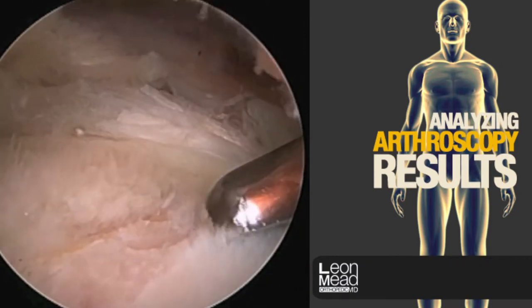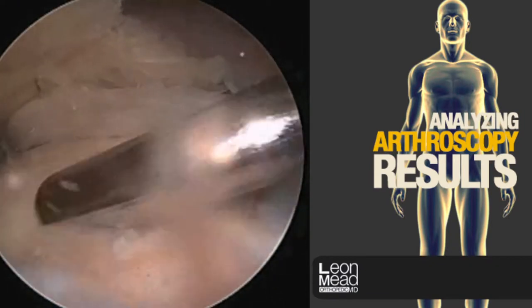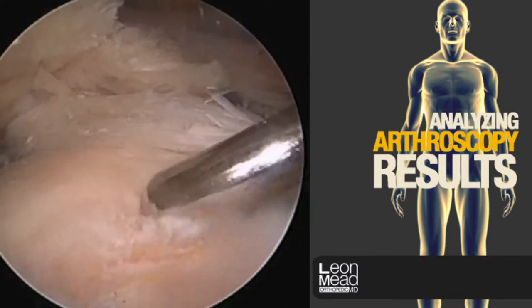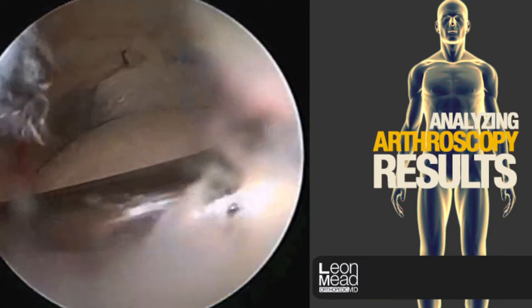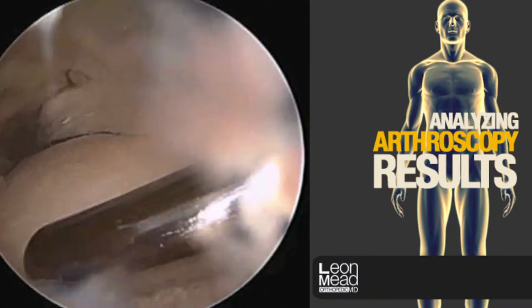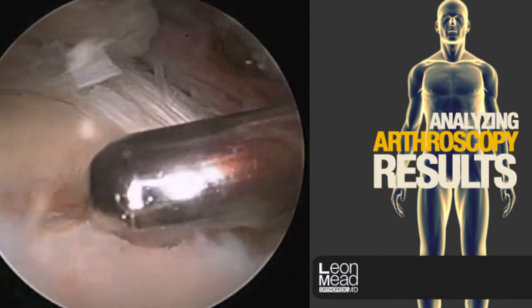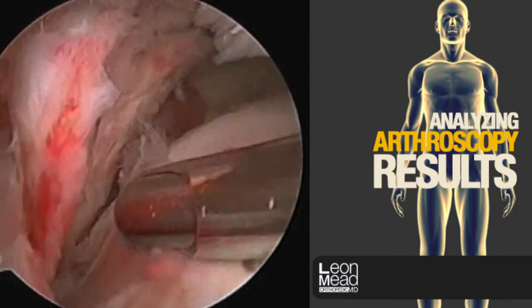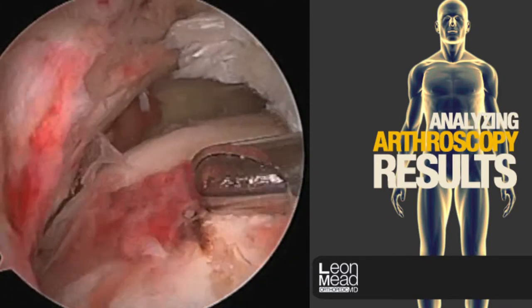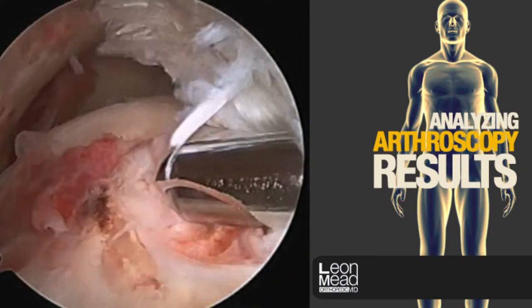We're now preparing the footprint of the rotator cuff. When the rotator cuff fails, it typically comes off the bone but leaves some tissue behind. Since it's the bone that heals to the tendon and not the other way around, it's important that we have the bone completely exposed so that it can reattach itself to the rotator cuff tendon. As you can appreciate, the tear is quite large here.